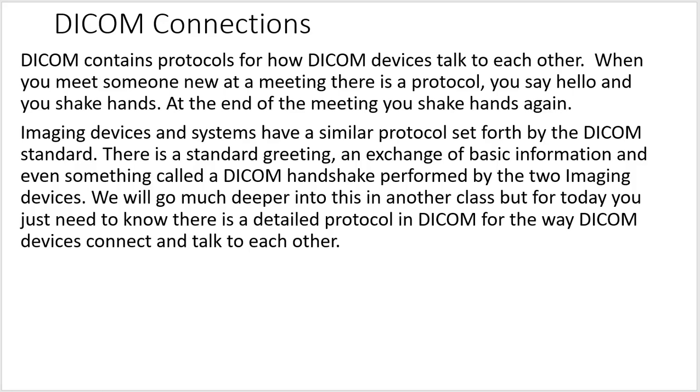DICOM connections. DICOM contains protocols for how DICOM devices talk to each other. When you meet someone at a new meeting, there's a protocol. You say hello and you shake hands, and at the end of the meeting, you shake hands again. We all know that as a common protocol for when humans interact. We always do those things. Well, machines have protocols for how they interact, and those are the DICOM standards.